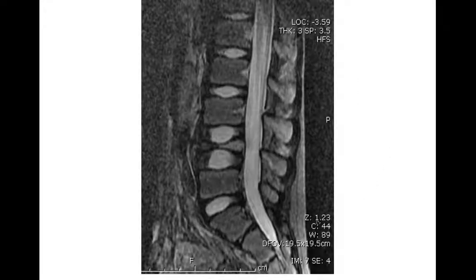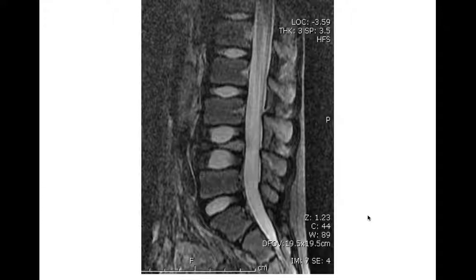Here's an MR in a child showing vertebra plana — the vertebral body is nearly completely collapsed and flattened. In a child, when you see this, you should think EG or Langerhans cell histiocytosis — that's your number one, two, and three choice because it's much more common in kids. Please don't say that in an adult. In an adult, EG is very unlikely, especially once they're over the age of 30 or so. EG is found in children and young adults.